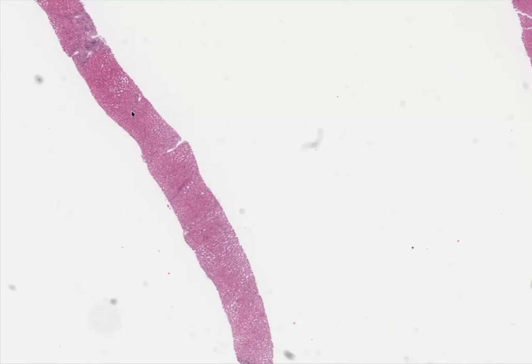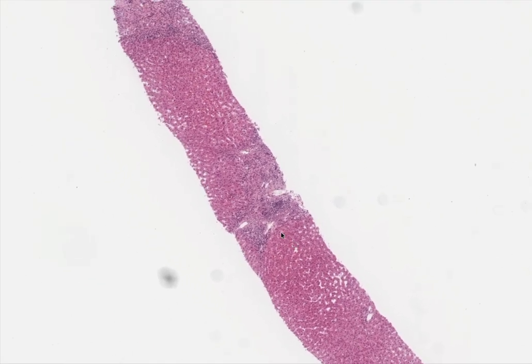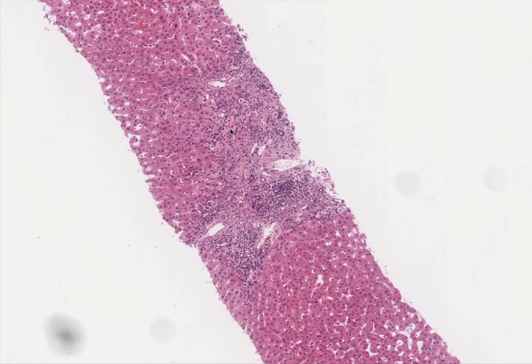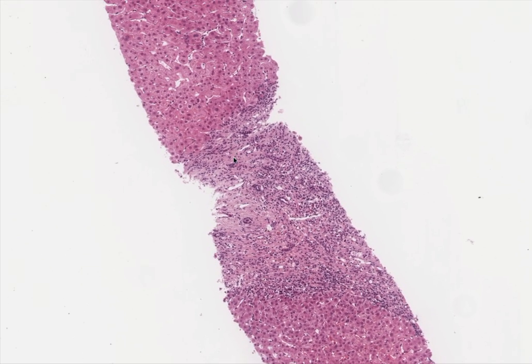In this liver biopsy, we start by looking at the architecture, and as we move along we can see that there is expansion of the portal tract with a suspicion of bridging fibrosis as it reaches out in this kind of stellate way. Moving along, we have another very wide portal tract here.